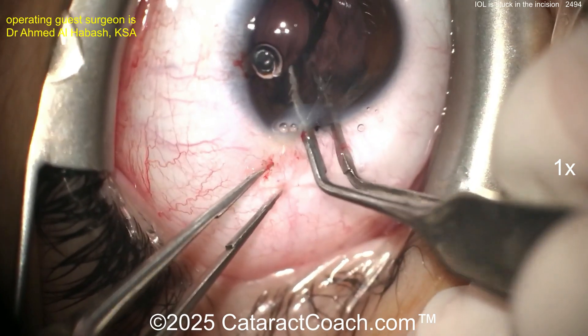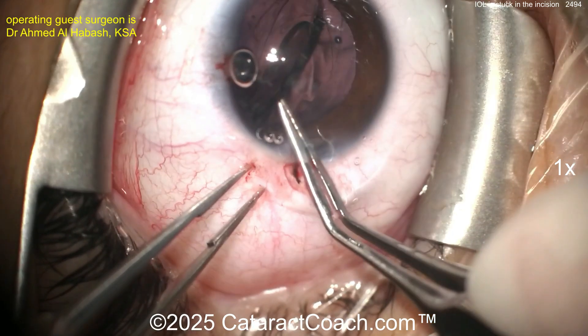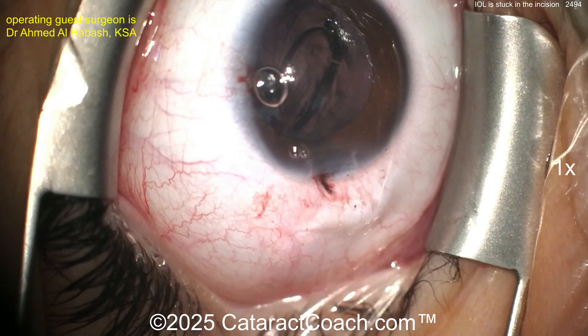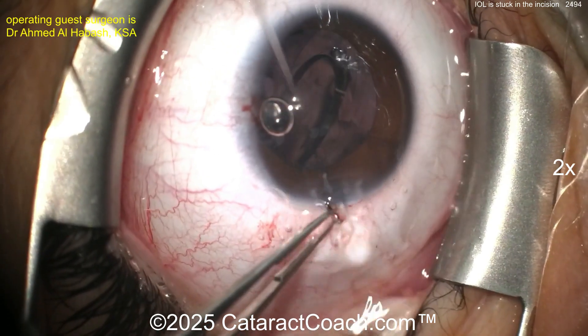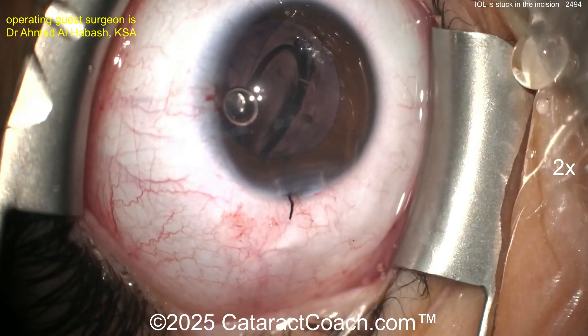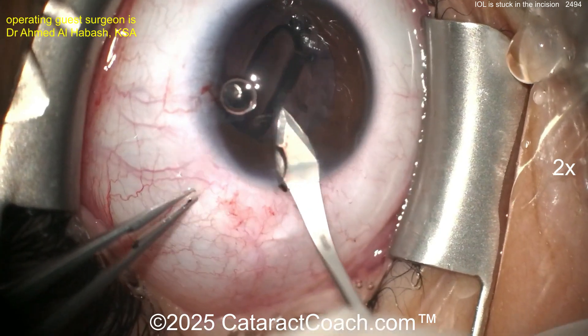Wow. Now what do you want to do? The capsular bag is open — you're not going to use this single-piece acrylic lens anymore. You've got to get it out. I think you're going to have to put a three-piece lens in and probably do an anterior vitrectomy. Again, I really want to thank our guest surgeon for sending in such an incredible video — this is how we all learn together.